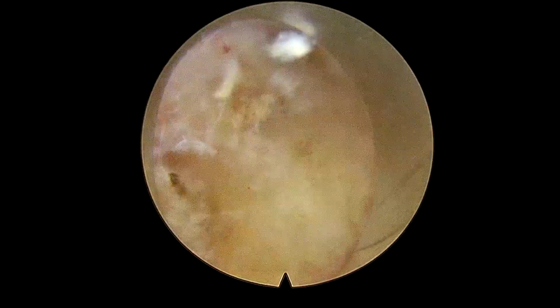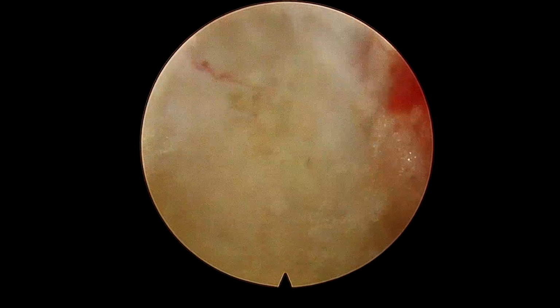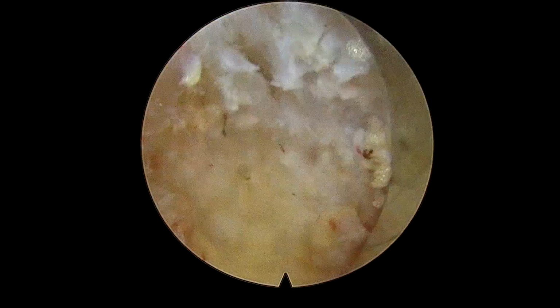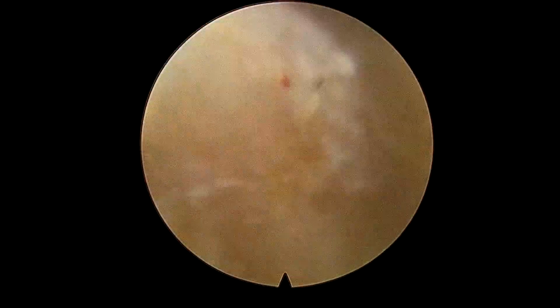The next step is to identify the landmarks. There are a few bony landmarks like the superior lamina, base of the spinous process, medial border of the inferior articular process, and then the inferior lamina. These are the landmarks which you should identify in each and every case, whether it is a stenosis case or a case like this where you do not have to do bony decompression. But the identification of bony landmarks is very, very important.